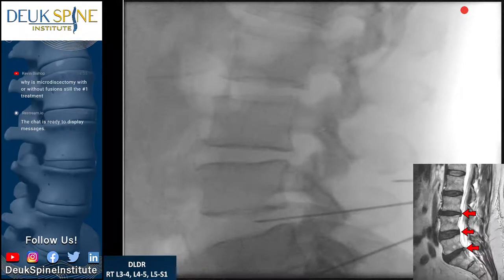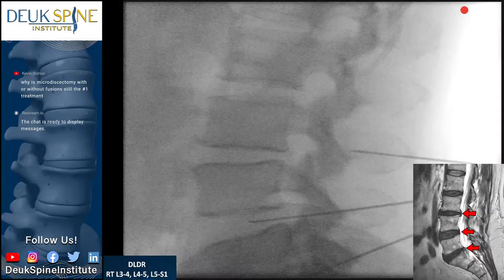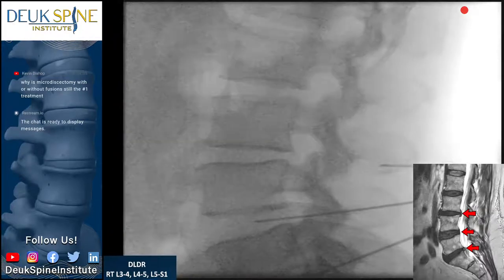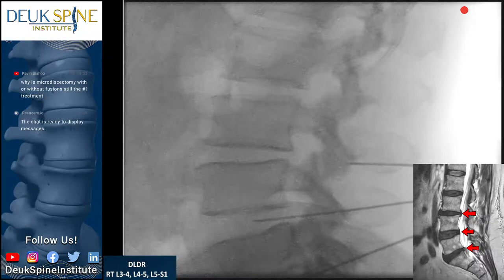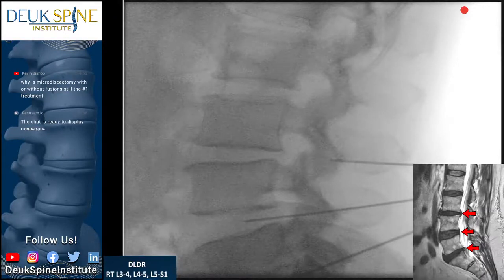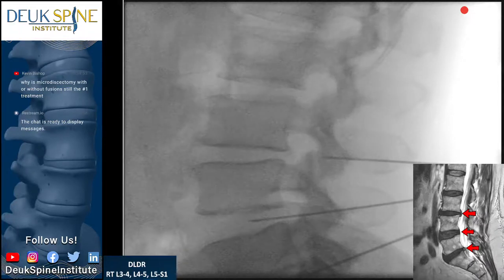All right, great. Shot? So we're using this x-ray machine to navigate to the next disc. And the x-ray machine shows me the spine. And the spine is what I'm using to navigate. Shot. You can see we're lined up nicely with the next disc, but I need to be just a little bit more posterior. Shot. Perfect. Shot. Yep. Looking good. Shot.